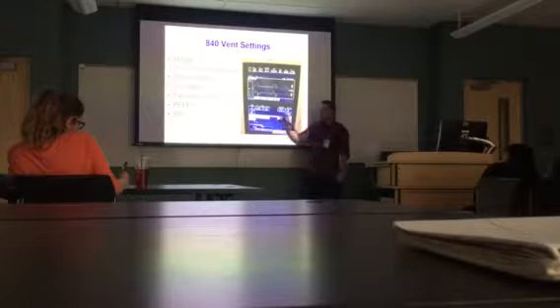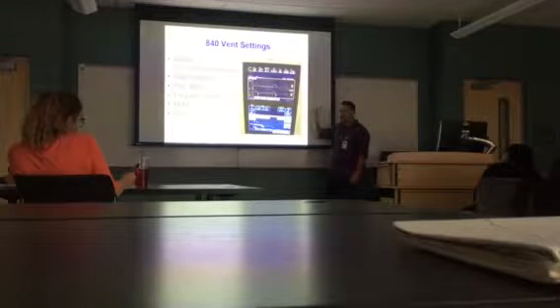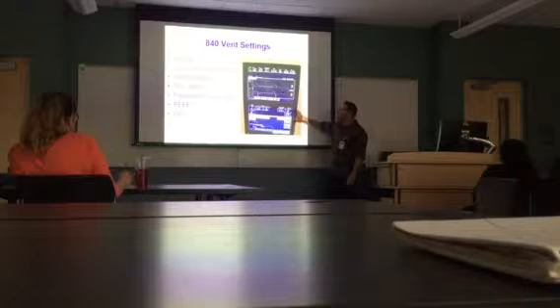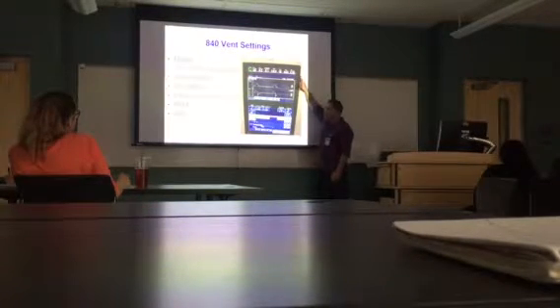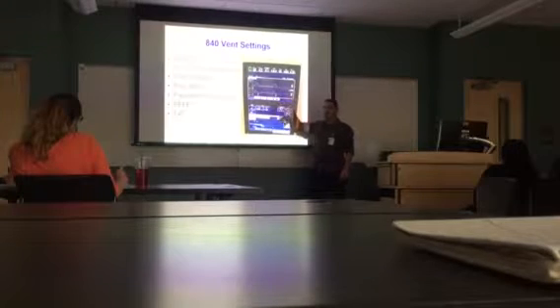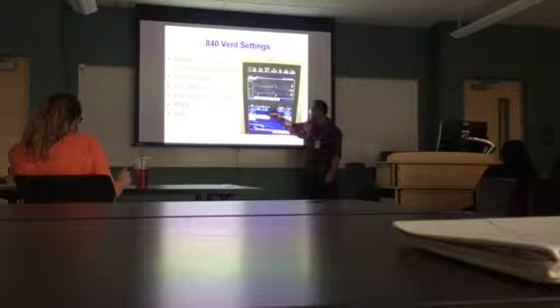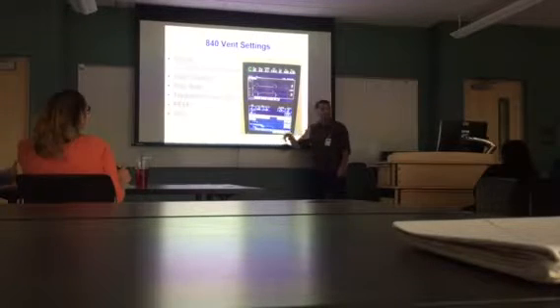Okay, so all these ventilators, whether invasive or non-invasive, are going to be separated into 3 categories. How do I want to ventilate the patient? What is the patient actually doing up on top? And then I get an inside look at what's taking place in the lungs. So this is not just for cool graphics. We actually look at this and analyze it and fine-tune the patient's ventilation, and we can touch it and turn it and adjust it based on what we see as an inside look of how we're ventilating the lungs.